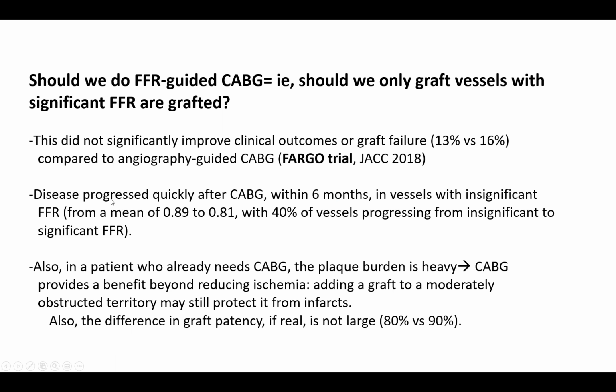Worse, in the trial, the disease progressed quickly after CABG in those non-bypassed vessels. Within 6 months, of vessels with insignificant FFR, 40% progressed to significant FFR. And the mean FFR of those insignificant vessels progressed from 0.89 to 0.81 6 months after CABG.